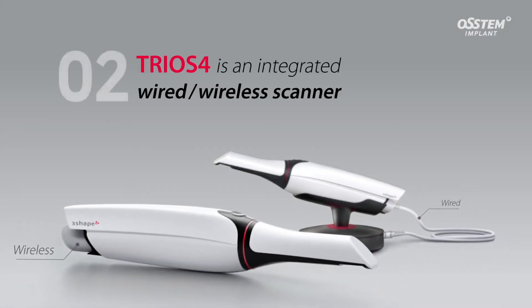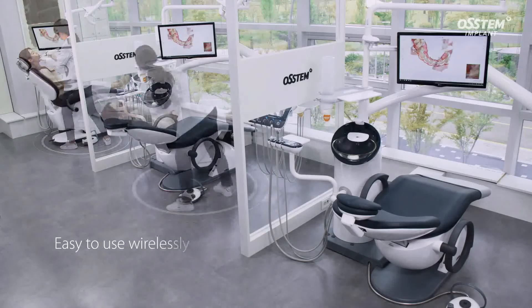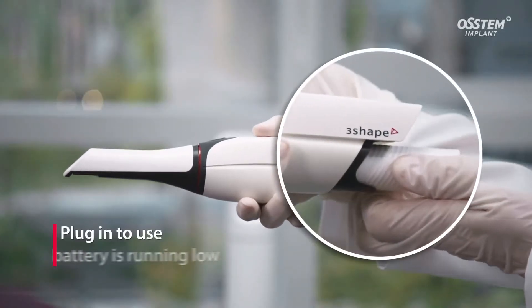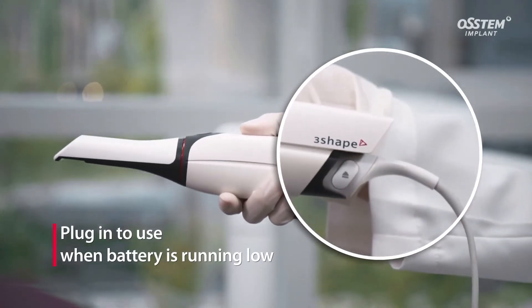The TRIOS 4 is an integrated wired and wireless scanner. It is easily used wirelessly at large dental clinics. If the battery runs out, clinicians can continue using the TRIOS 4 by plugging in its power cable.